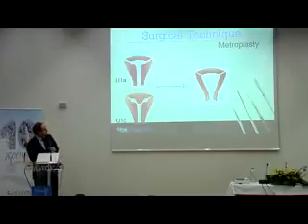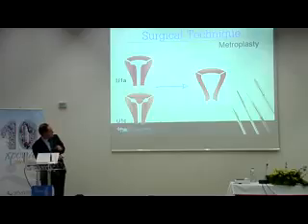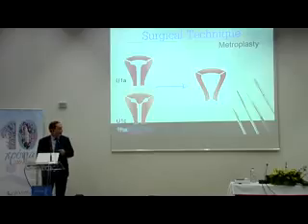Now, if you do the treatment, there are a lot of techniques, but as I'm a microsurgeon, I like to do it in a very gentle and very anatomical way. So we just cut. We do not remove anything. We don't use electricity, only scissors. We cut and we make the normal, it's plastic surgery, normal pear shape-like pattern.